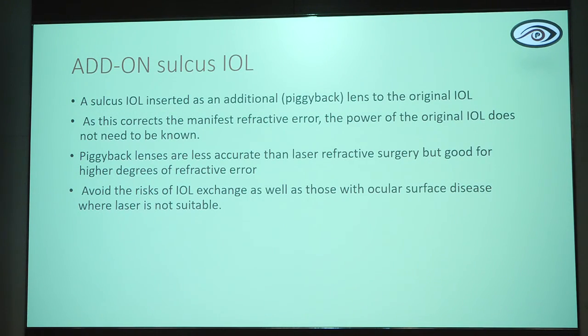So add-on sulcus IOL, I think it is becoming much, much more popular. A lot of patients are coming to us. I think these piggyback lenses are giving very good results. The only thing is you need to know exactly how to do it. If you ask the company, they will tell you how to inject. You can put it over the previous lenses. Piggyback lenses are less accurate than laser refractive surgery, but definitely good for high degrees of refractive error.